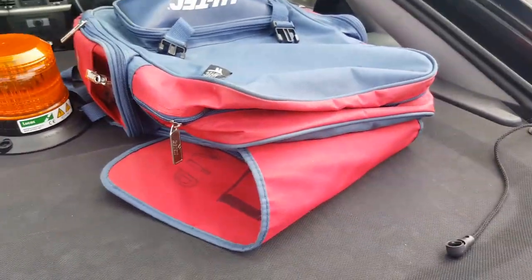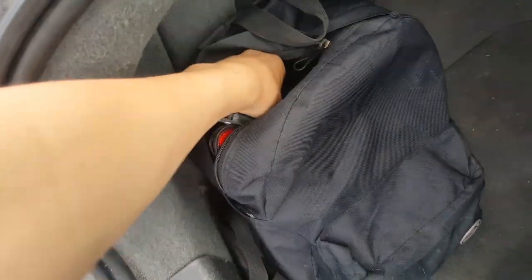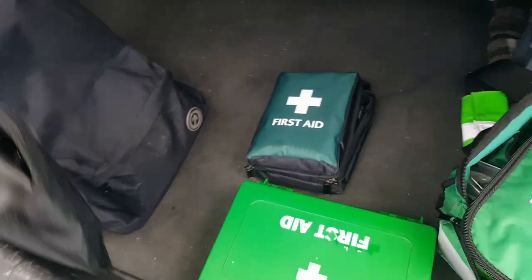So those are the basic first aid items we carry. We've also changed the highways bag — that used to be the highways bag but now it's this one — and we actually have the lightweight foldable shovel in here as well now.